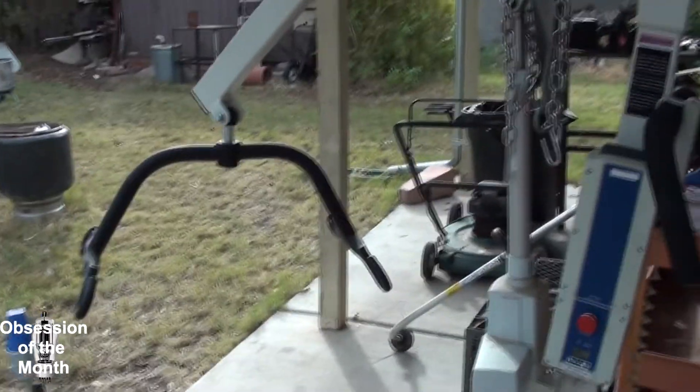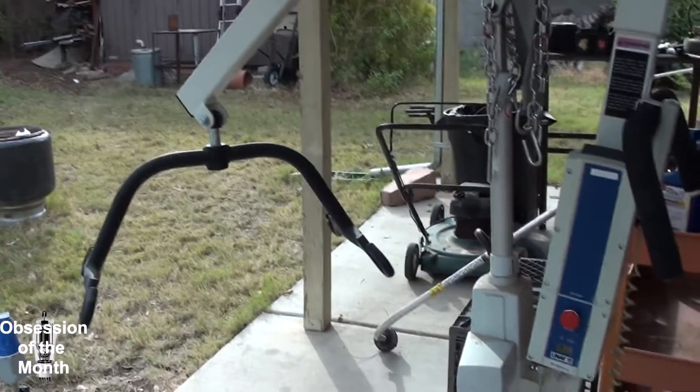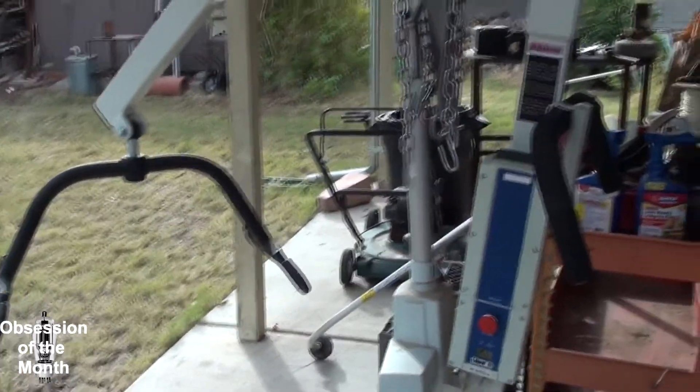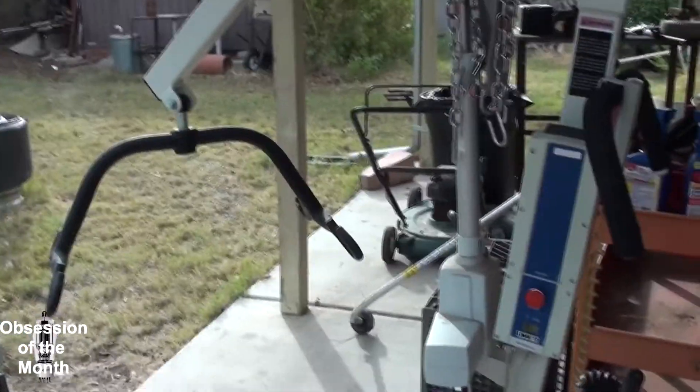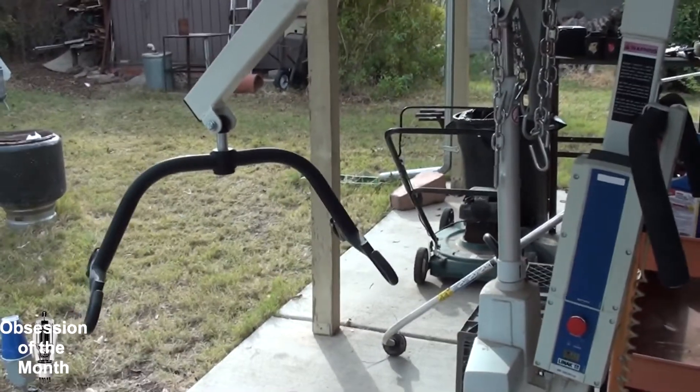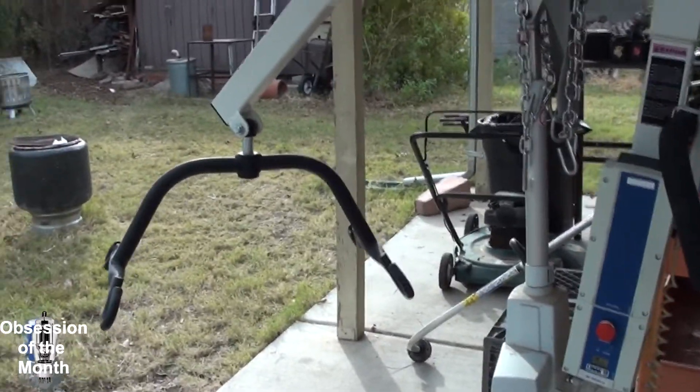At the end of that three-foot arm it can handle 600 pounds. I suppose if you were to extend it another foot or two, it would probably handle two or three hundred pounds at that distance.